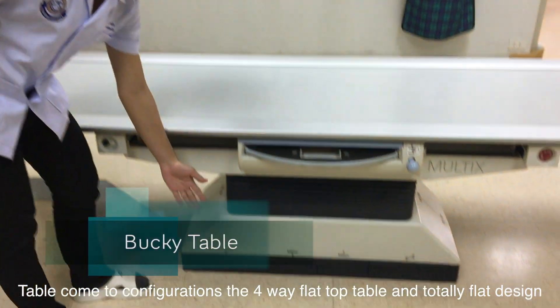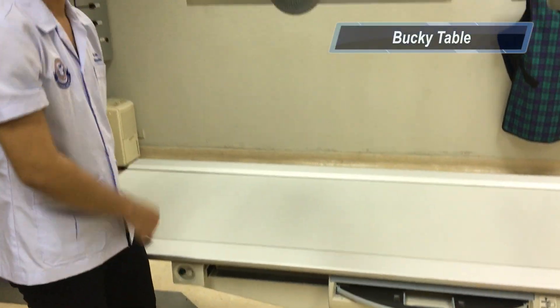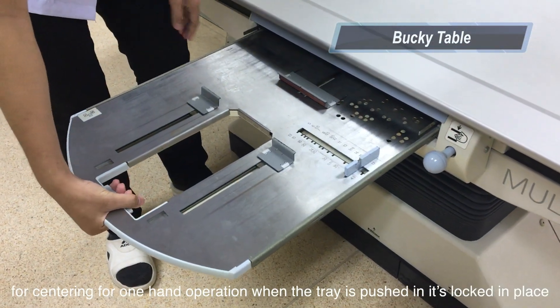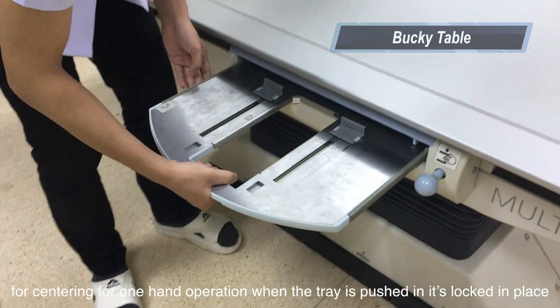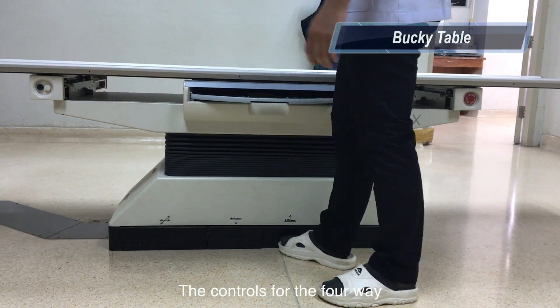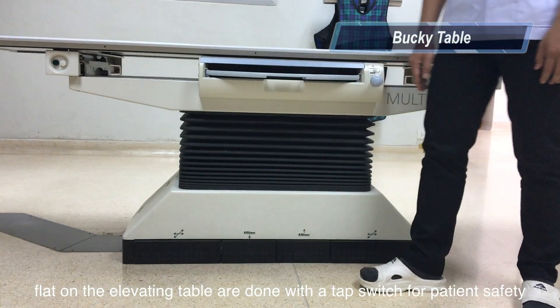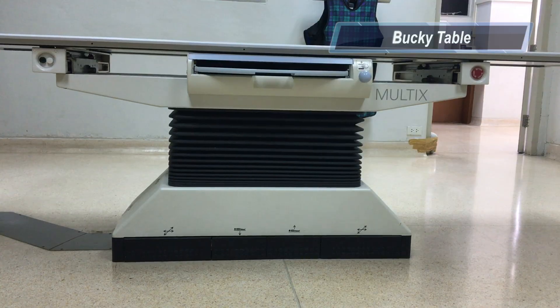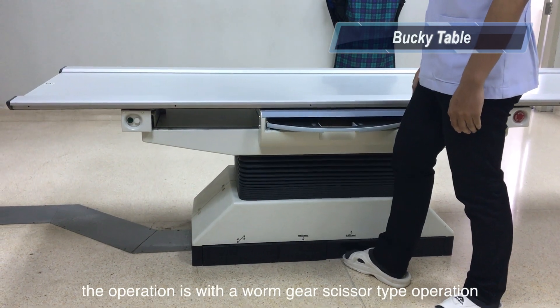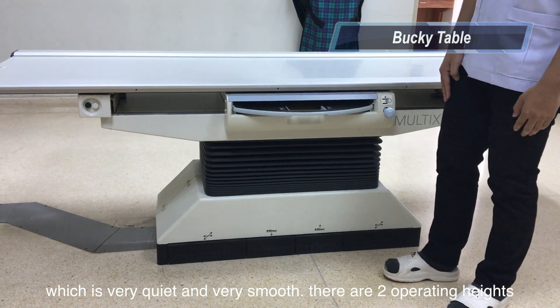The table configuration features a 4-way float top table with a totally flat design. The grid is unlocked when the tray is removed for centering with one-hand operation. When the tray is pushed in, it is locked in place. Controls for the 4-way float on the elevating table are done with a tap switch for patient safety. The elevation is controlled with the tap-elevate button, and the elevation uses a worm gear scissor-type mechanism which is really quiet and really smooth.